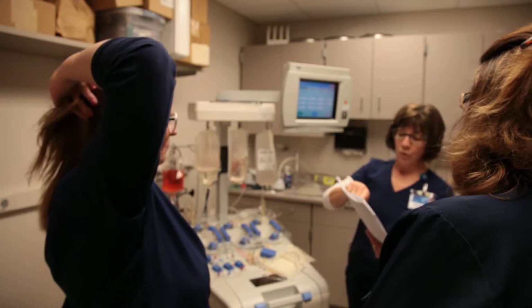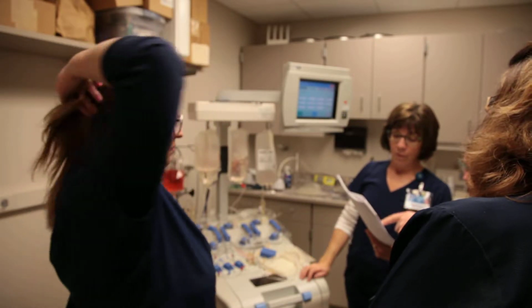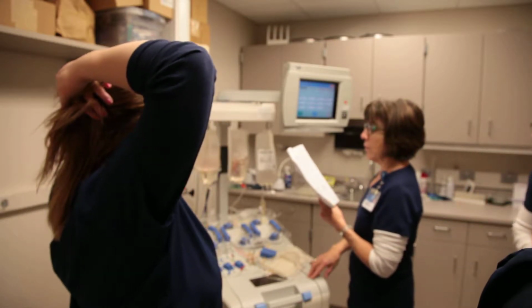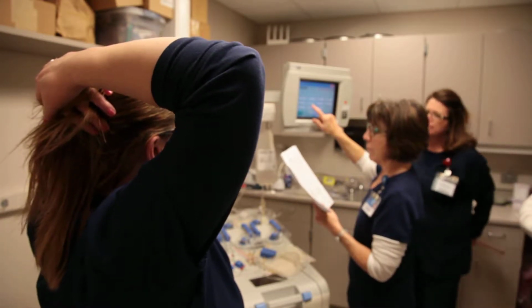So if they're greater, you use this column. See, some of these numbers are different. Your cycle volume is more. These are just the settings that you're going to use. So you want to change your AC rate first.